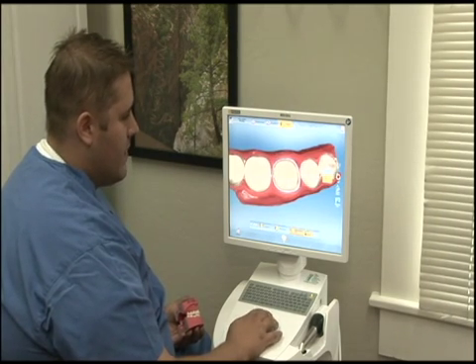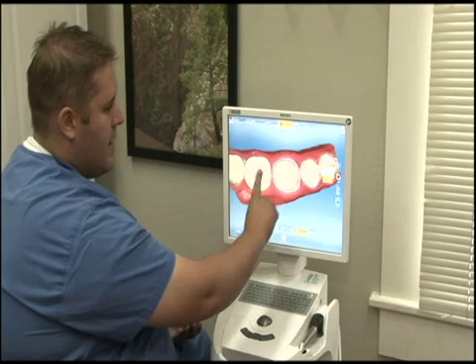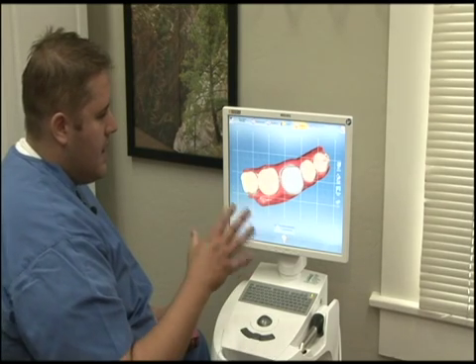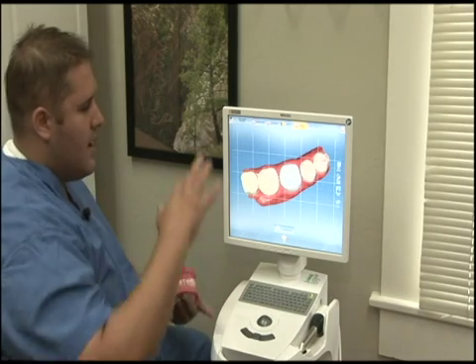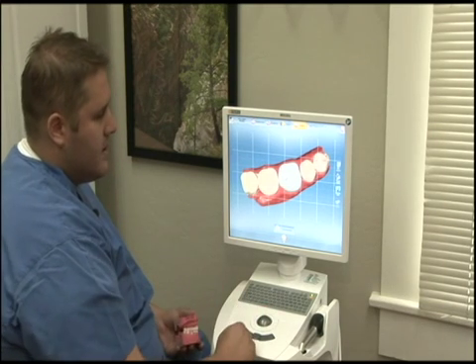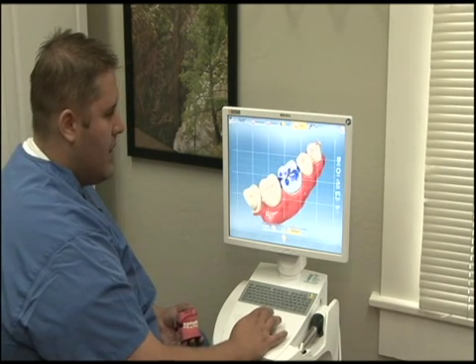a proposal for us, which is really nice. It's going to take your half of this tooth and your half of this tooth and compare those to a library of millions of teeth that it has, the anatomy of the teeth, and then it's going to design a crown that fits widthwise and height-wise with all the little bumps and grooves that a tooth should have, so that we can give you a perfect crown that fits extraordinarily well, all in about 2 hours from start to finish, instead of having to wait 2 to 3 weeks.